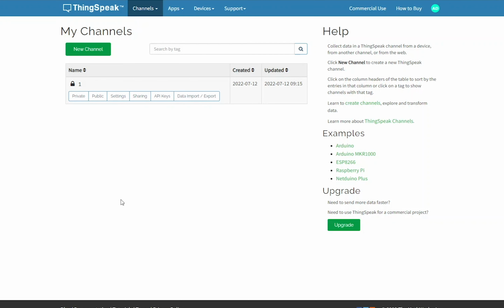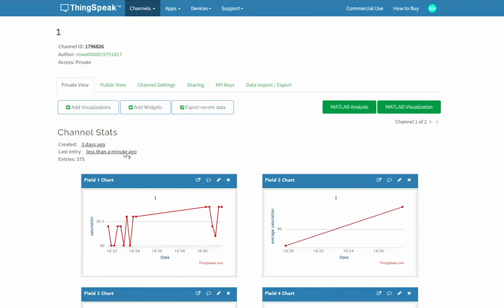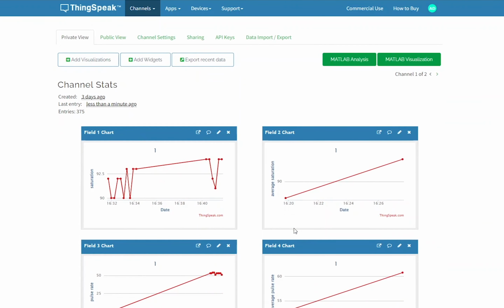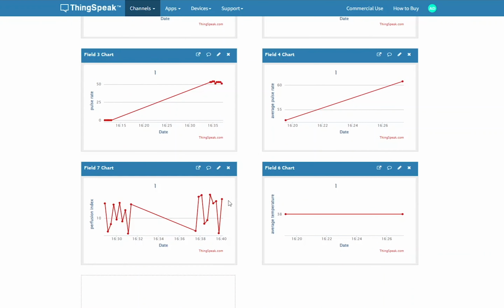To conclude, I will open the ThingSpeak dashboard as a doctor, so I can see the data for each patient of the nursing home. In particular, in this case, for patient 1, I can see data collected over time, and for each type of data, even the average.